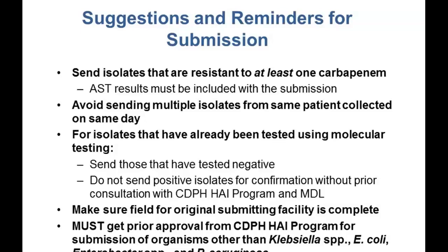For isolates that have already been tested using molecular methods, only send those that tested negative. No need to submit the positive isolate for confirmation. But if there's a need to do so, please contact the HAI program and MDL for approval. And we also ask to make sure the field for original submitting facility is completed. This piece of information is very important for the epidemiologist to track the antibiotic resistance and effectively control the spreading of AR strains.